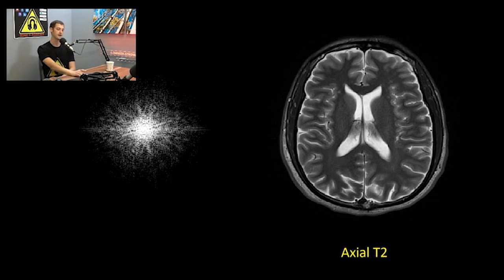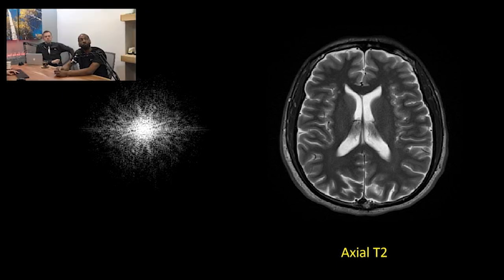And that's the case for tons of MRI images, almost all MRI images. There's things like spectroscopy, which aren't really images, but they still involve Fourier transforms. Yeah, looking at this, I feel like every MRI tech wants to make it like this, from one image to the other, linear, right?